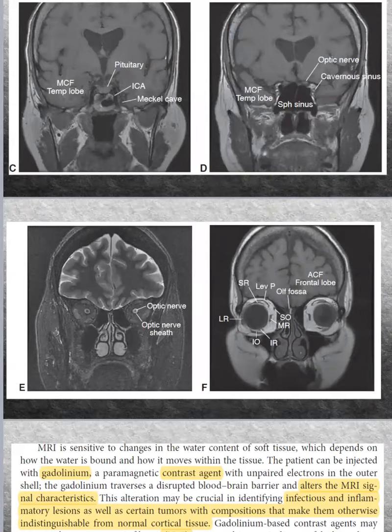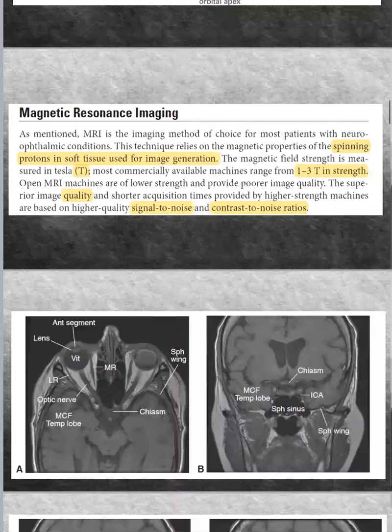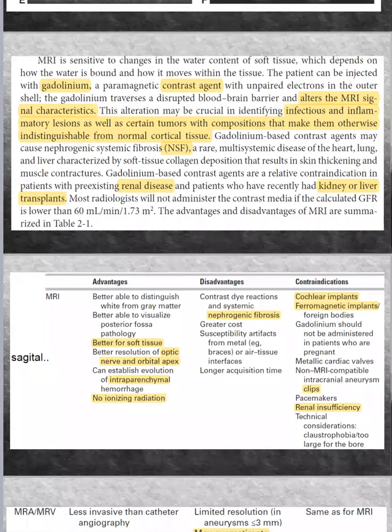Here I also have something different, which is the coronal section. Can you see this coronal section? Yes, this is the superior one, which is the brain, and below it I have the optic nerve. But this is with fat suppression. Here I suppressed fat in order to see the optic nerve well, but here this is without fat suppression. So these are all the MR sections. I have also the sagittal section, which is exclusive to the MRI scan.